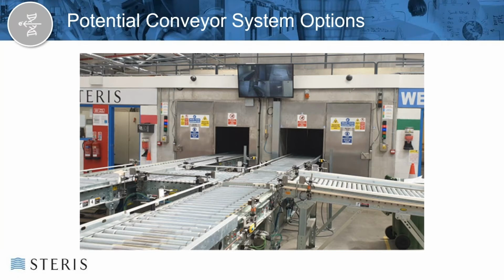What you're viewing here really is this outside area of the conveyance, and that element in the middle, I believe, is where there can be a pass-through. So that's that transit there where the product can go through a single pass and go back to the entrance to the input again and get irradiated on the opposite side of the load.